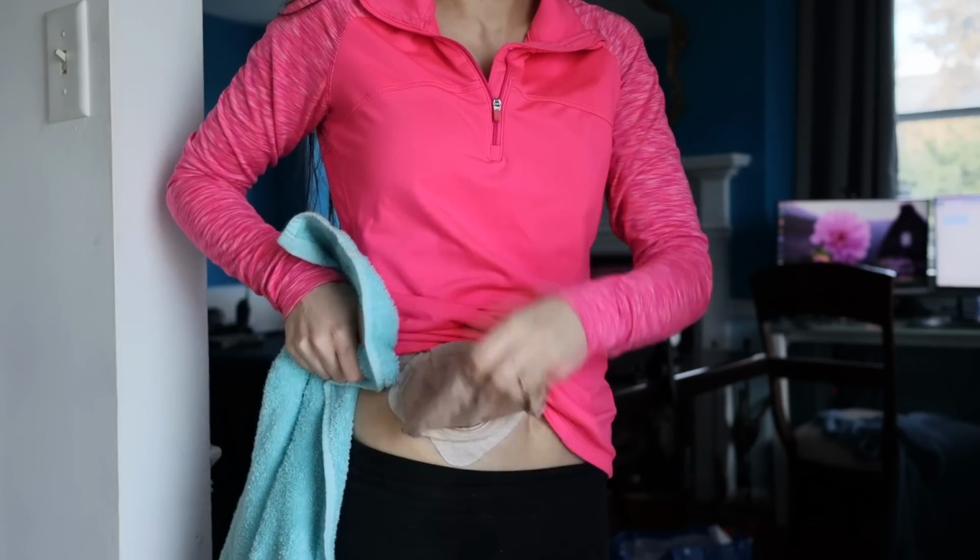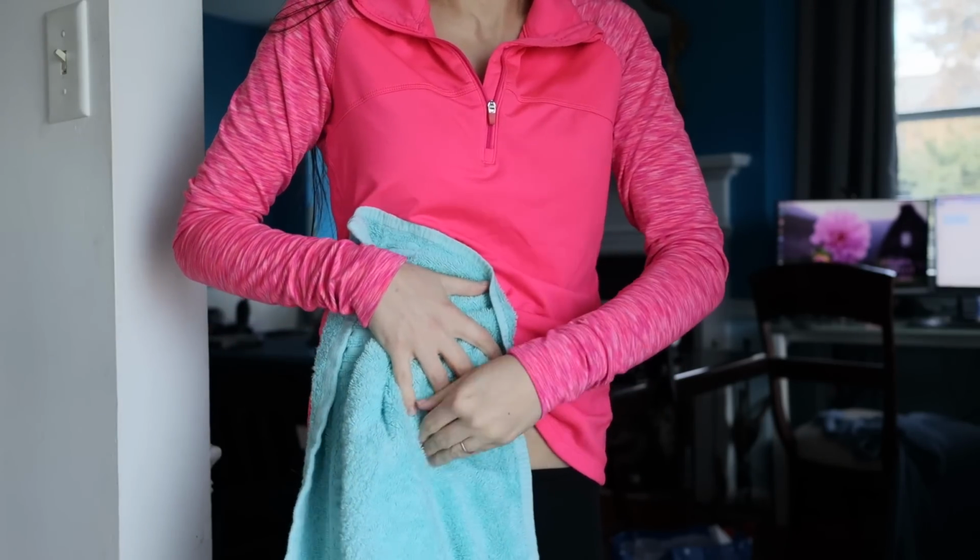Finally, I get dressed, I've got my makeup on, I'm feeling good for the day, and I head downstairs. Except I forgot one thing in my routine. When there are many things that you have to think about, I tend to forget one or two things. So I grabbed a towel downstairs and I patted my ostomy dry. I do this around the whole bag as well as around the flange itself, because if I leave it damp, it will tend to irritate my skin and potentially start a fungal infection. I like to tuck my ostomy into my pants now, and in that dark environment, things can grow and multiply, I have learned. So I took care of that, and finally I am getting ready to start my work.